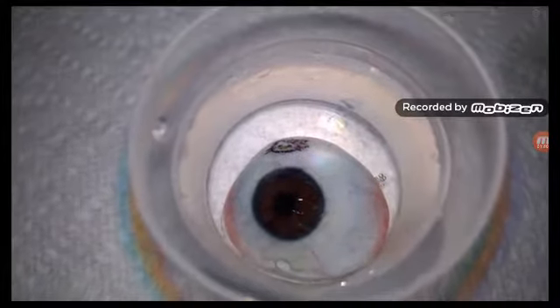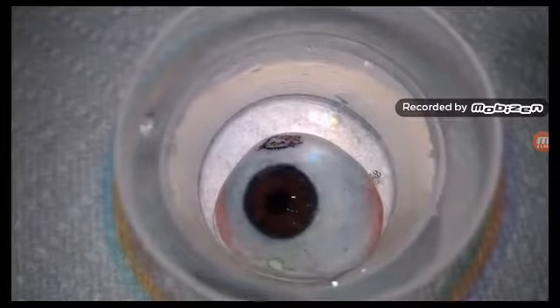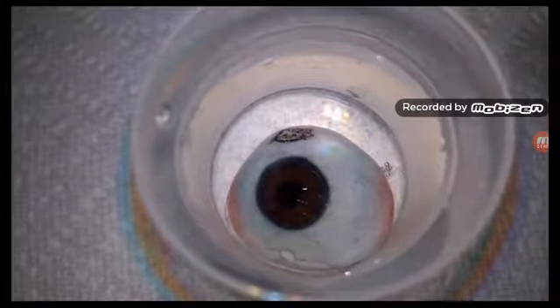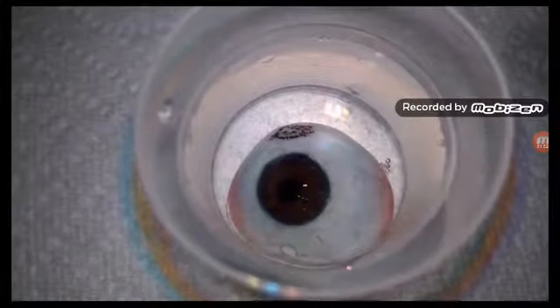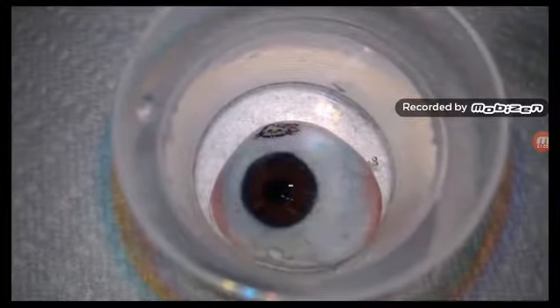I just wanted to show you all the intricate details of a prosthetic eye, like those little red veining. Some doctors will use little red fibers, some doctors will hand paint these. There's just a lot of work that goes in to make your prosthetic eye look natural.